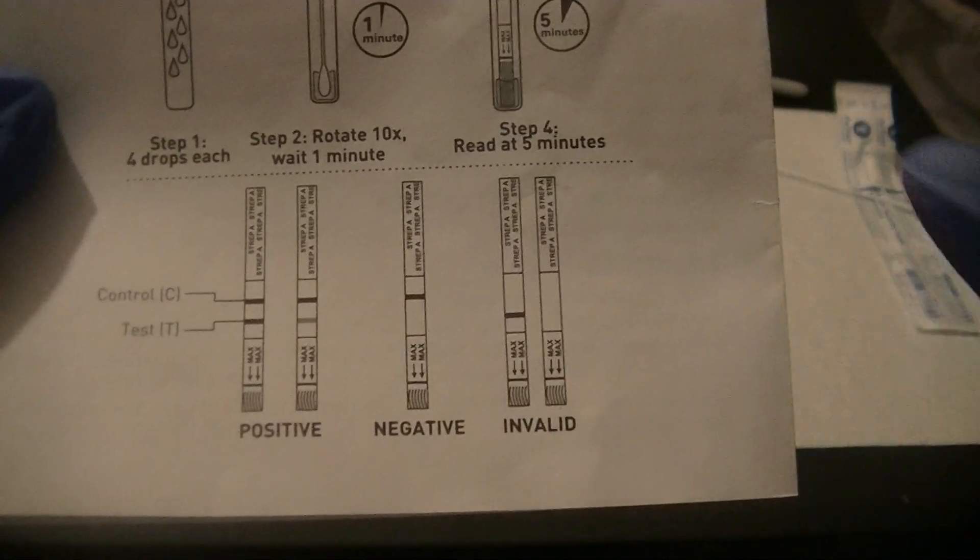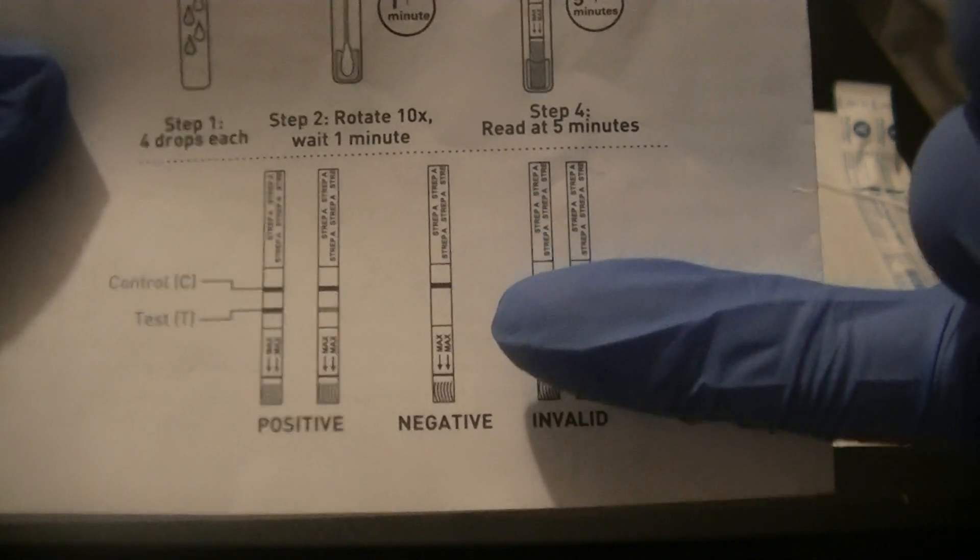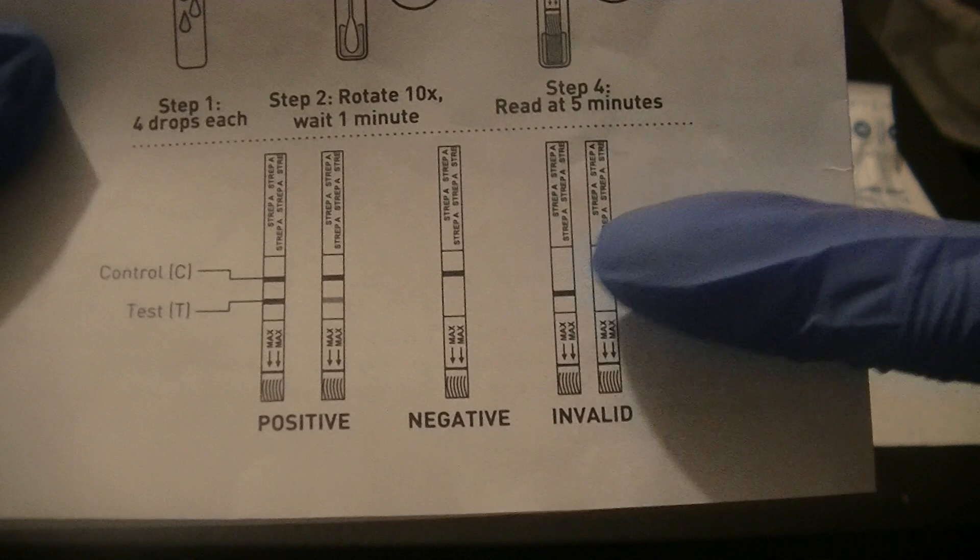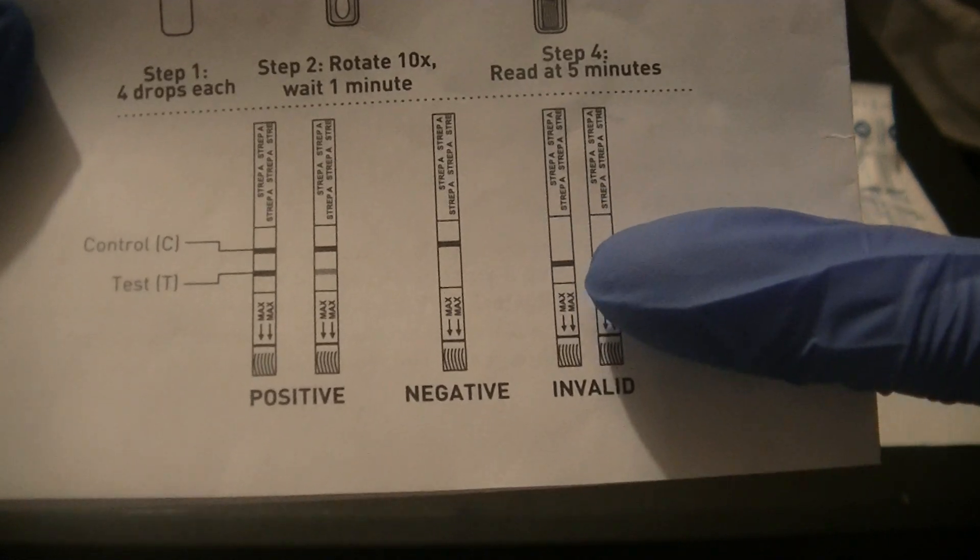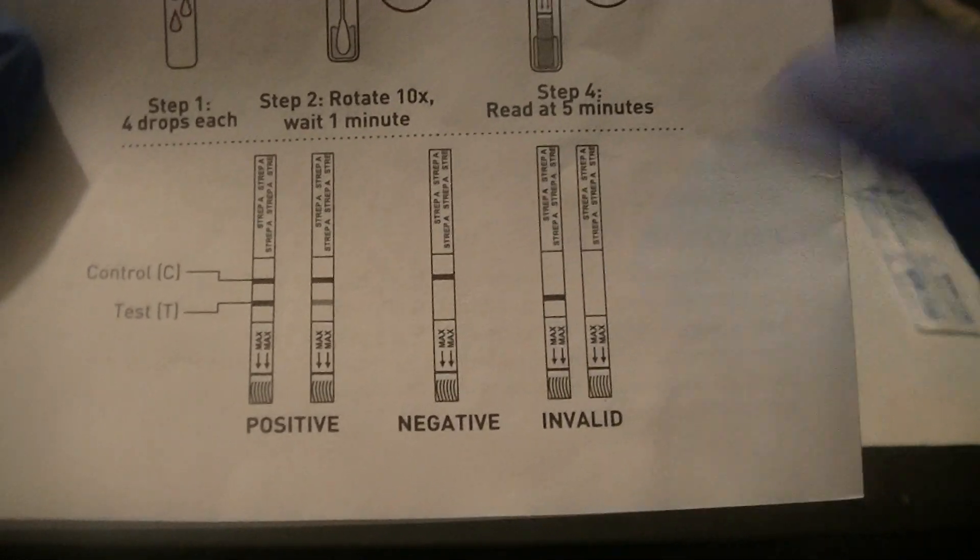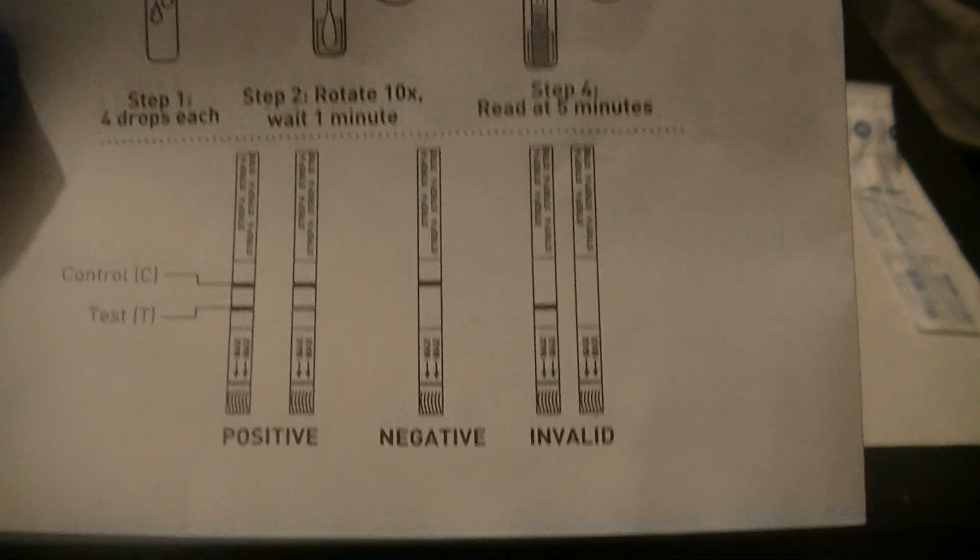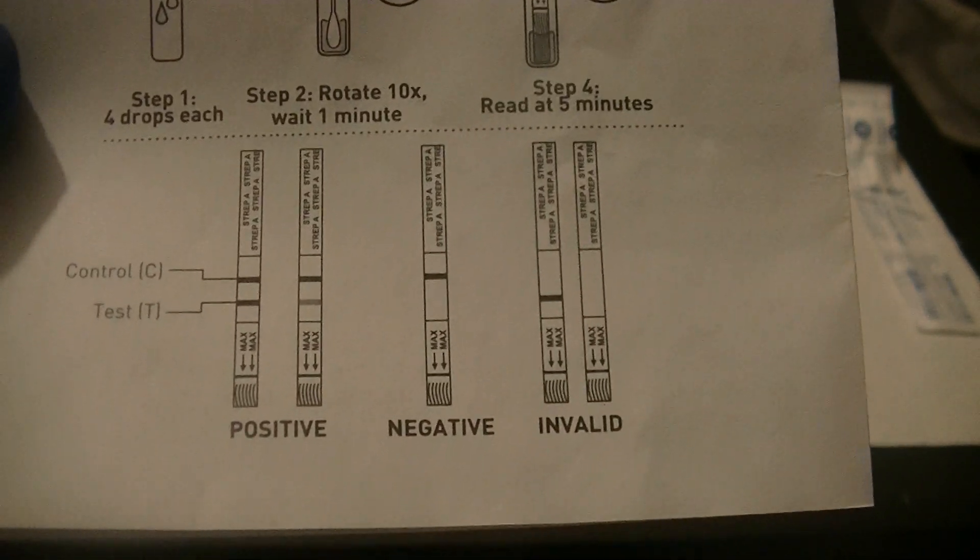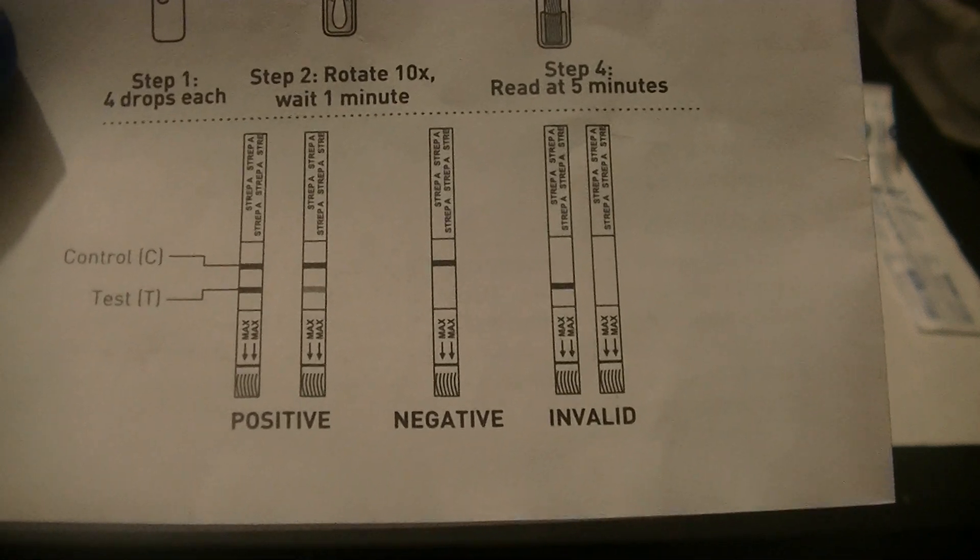A negative test will show you a control line but no test line. And an invalid test, if there's no control line, even if you see a positive line in the test area, we cannot trust the test because the sample did not travel all the way through the testing area on the immunoassay stick.